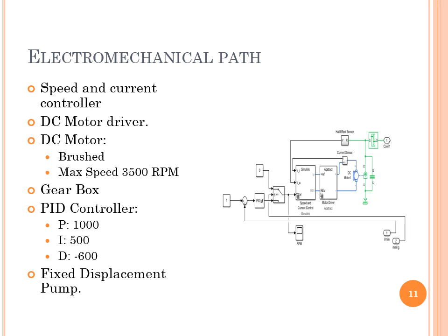Next, we have the speed and current control for the DC motor. Used to control the DC motor, the controller uses a feedback system based on a Hall effect sensor to reach and keep the desired motor speed. Then we have the DC motor driver. It amplifies the current received from the motor controller into the appropriate electrical current for the DC motor to move it at a desired speed and direction.